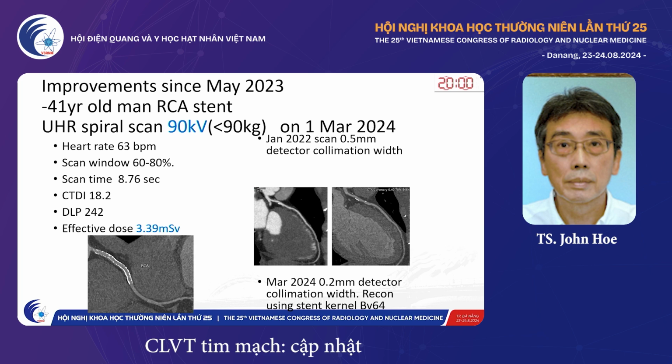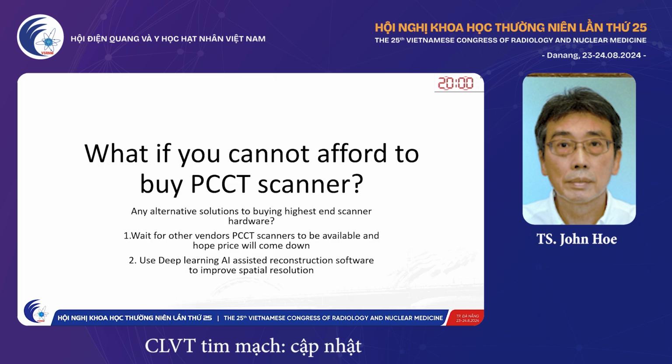However, since May 2023, there have been some improvements because PCCT is a new technology. Now we can scan using 90 kV, and you can see the effective dose has come down, and of course the image quality is very good.